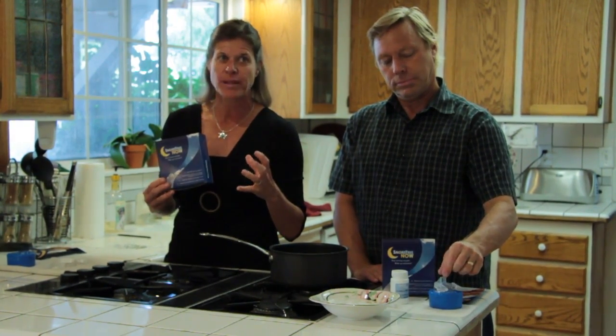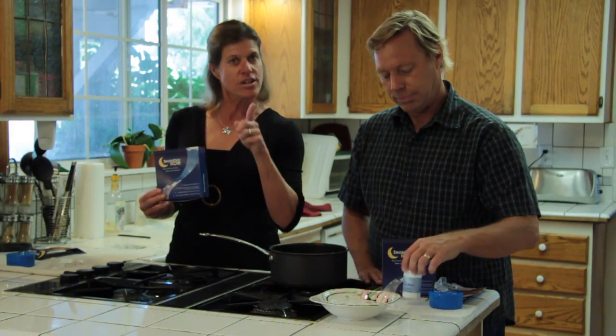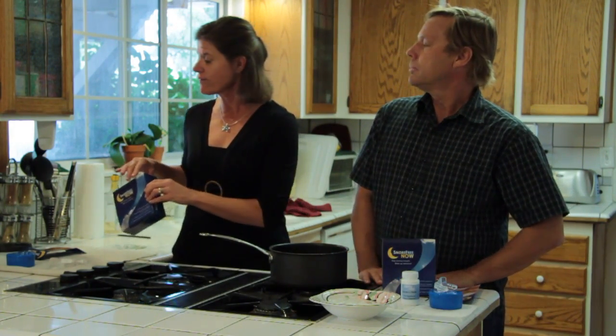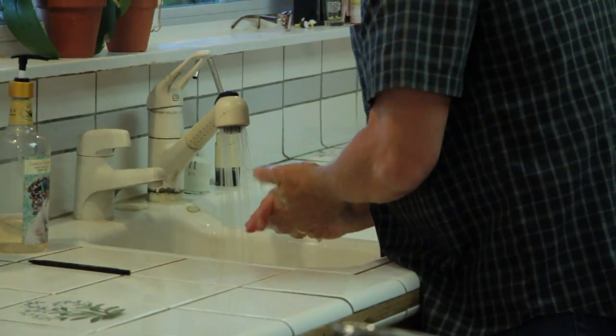And we're going to go through this first as a practice, and then we will literally show you how to do it. So we'll go through steps. The very first thing that you want to do before we even go through it though is wash your hands. You need a clean workstation as well as your own hands.